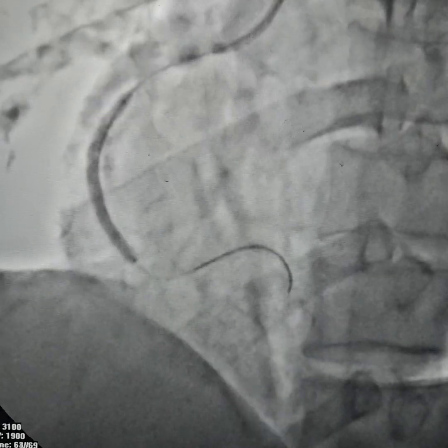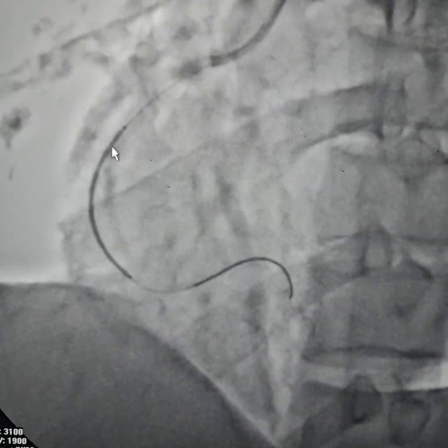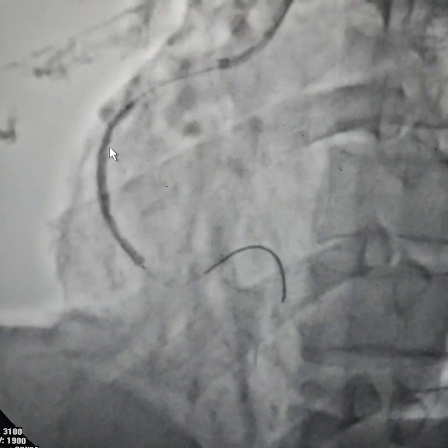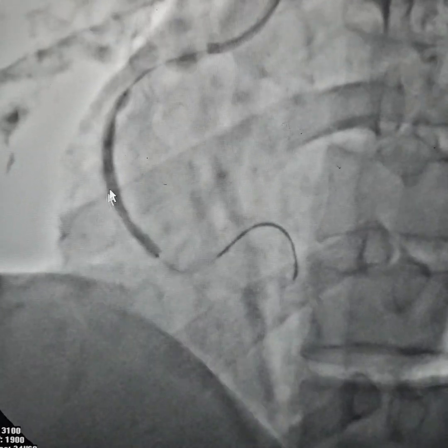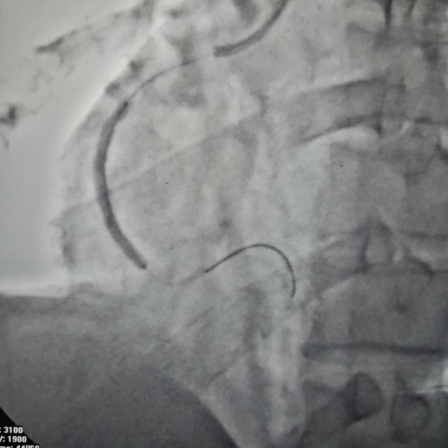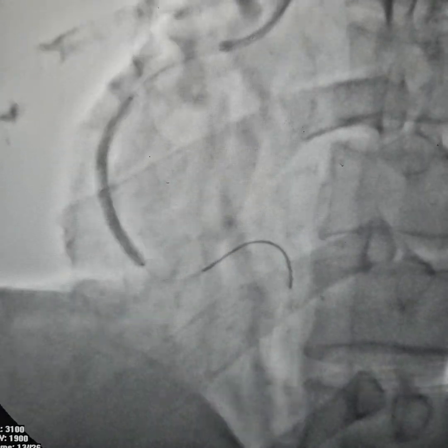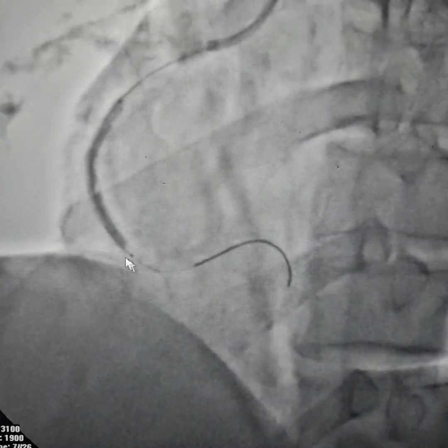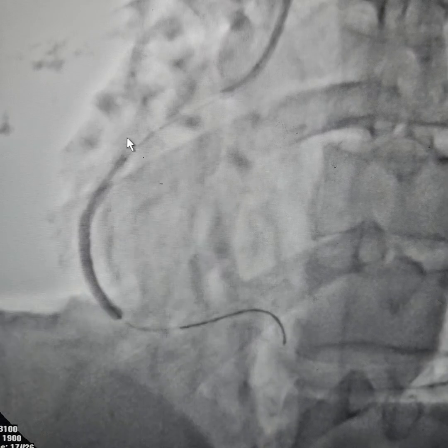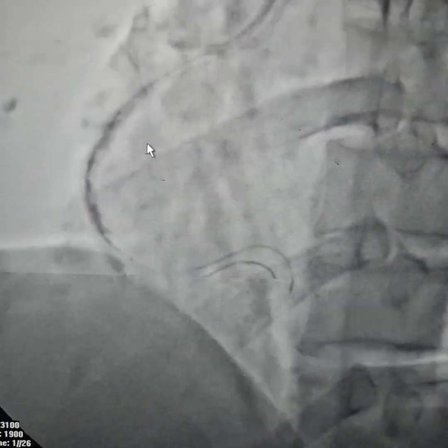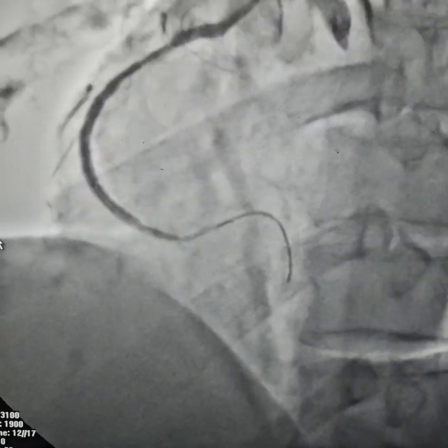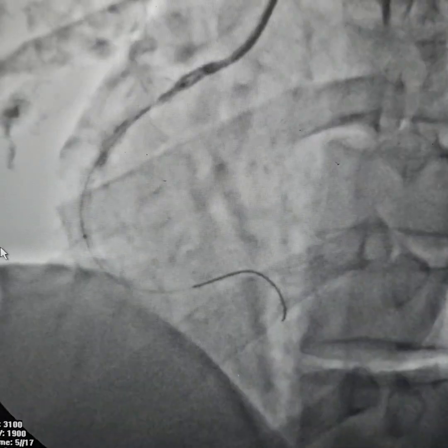The stent inflation is at 10 atm pressure, which is the normal pressure. We're inflating it again, and as you can see, the first stent has fully expanded — good expansion has been achieved.